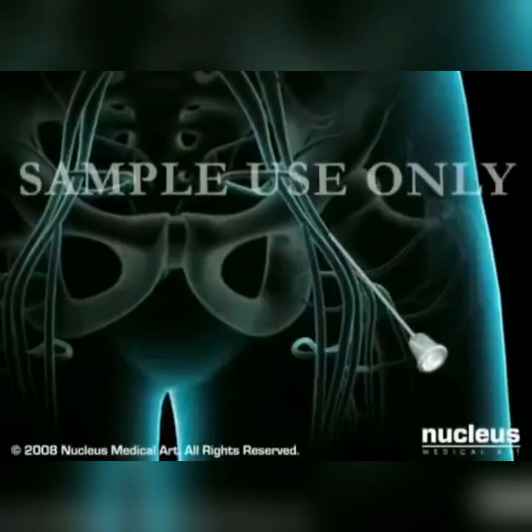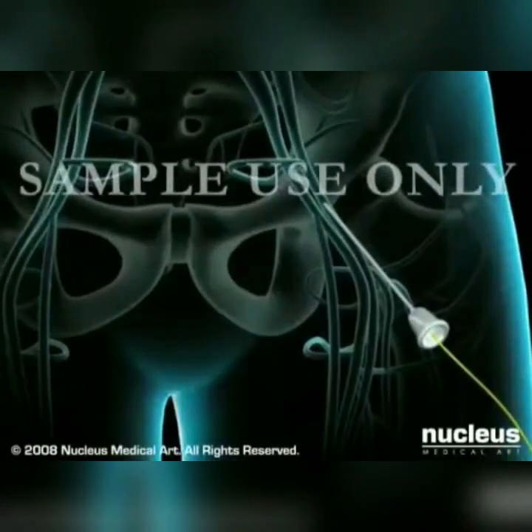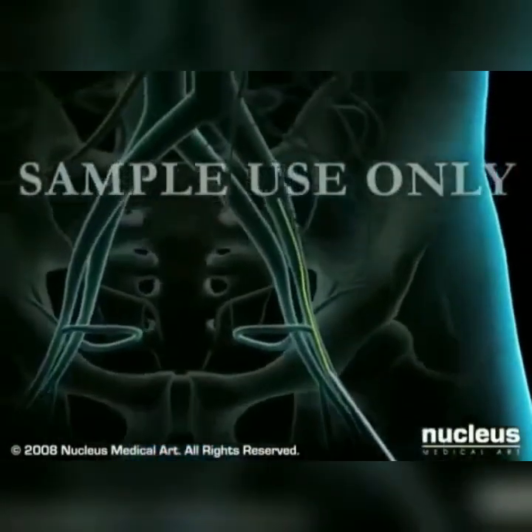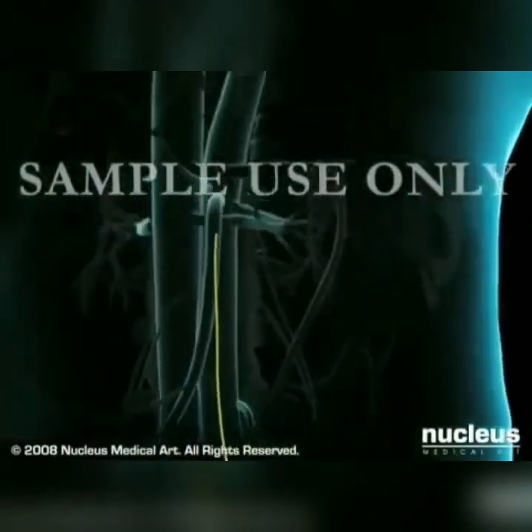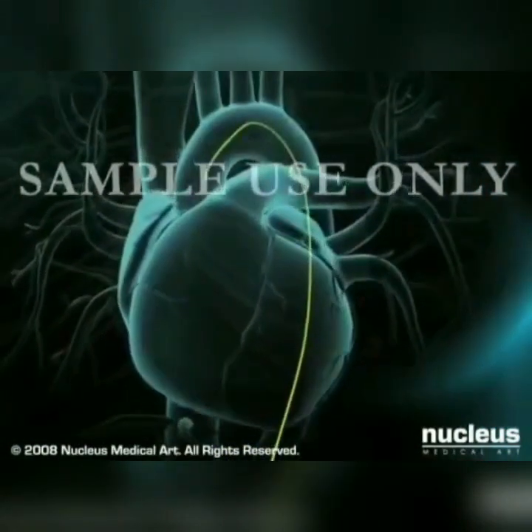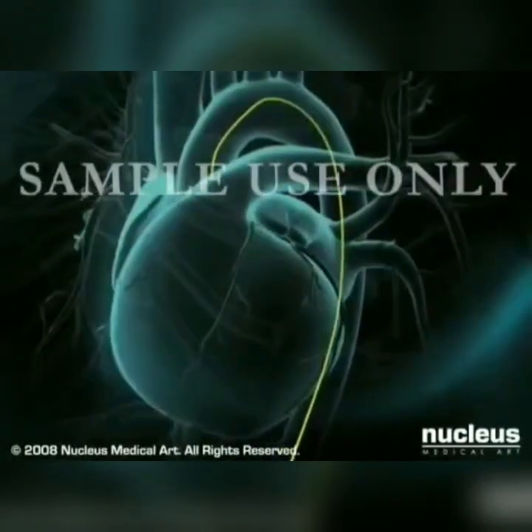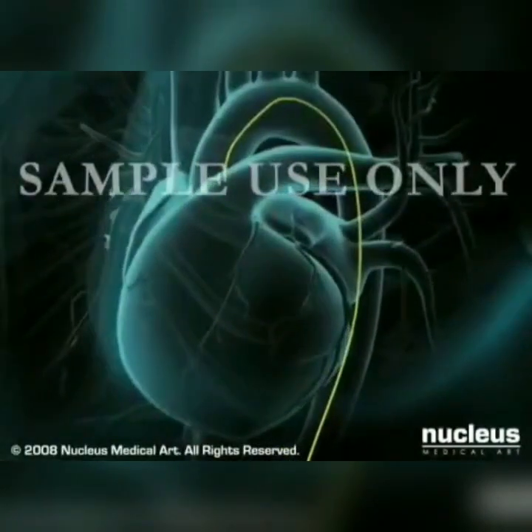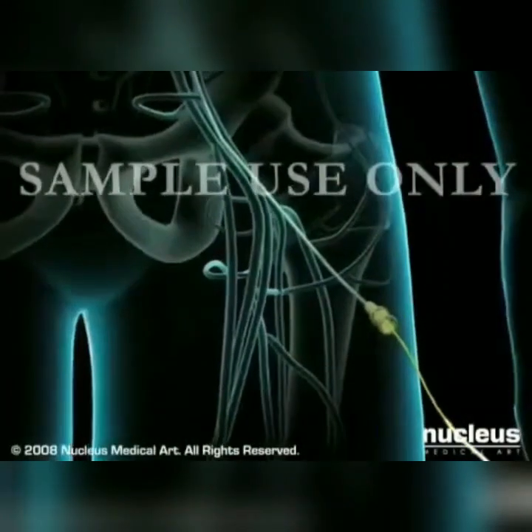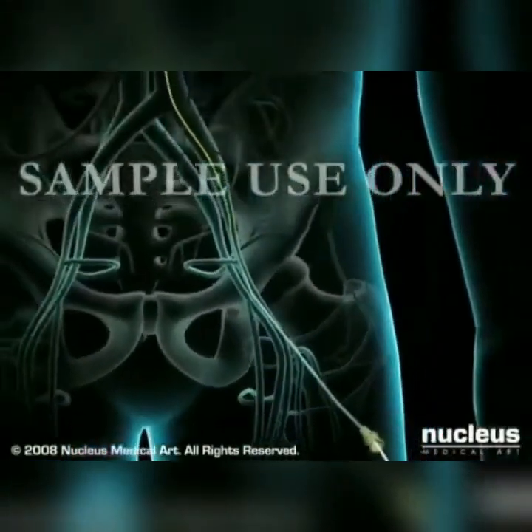The doctor numbs the skin in your groin area and inserts a needle into your femoral artery. Once the needle is placed, a wire is passed through the needle and gently guided through the arterial system to the heart. The needle will be withdrawn and exchanged for a small flexible tube called a sheath that permits access to your femoral artery. Next, a soft, flexible catheter will be slipped over the wire through the sheath and threaded up to your heart.